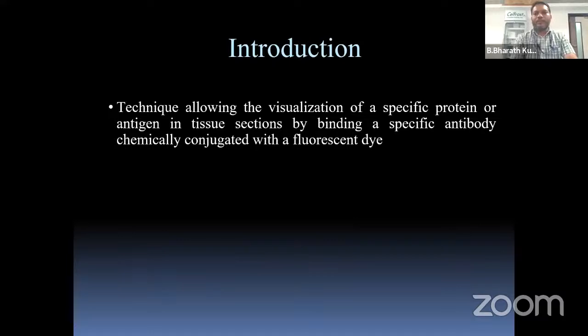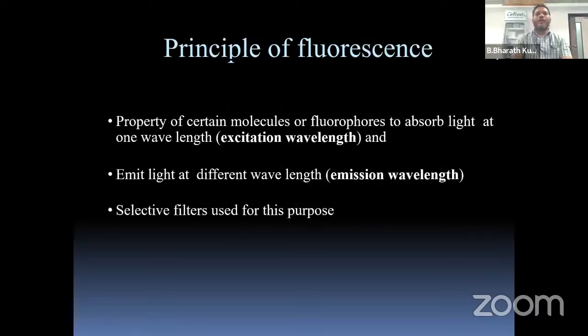Introduction of IF. It is a technique allowing the visualization of a specific protein or antigen in the tissue section by binding a specific antibody chemically conjugated with a fluorescent dye. Principle of fluorescence.